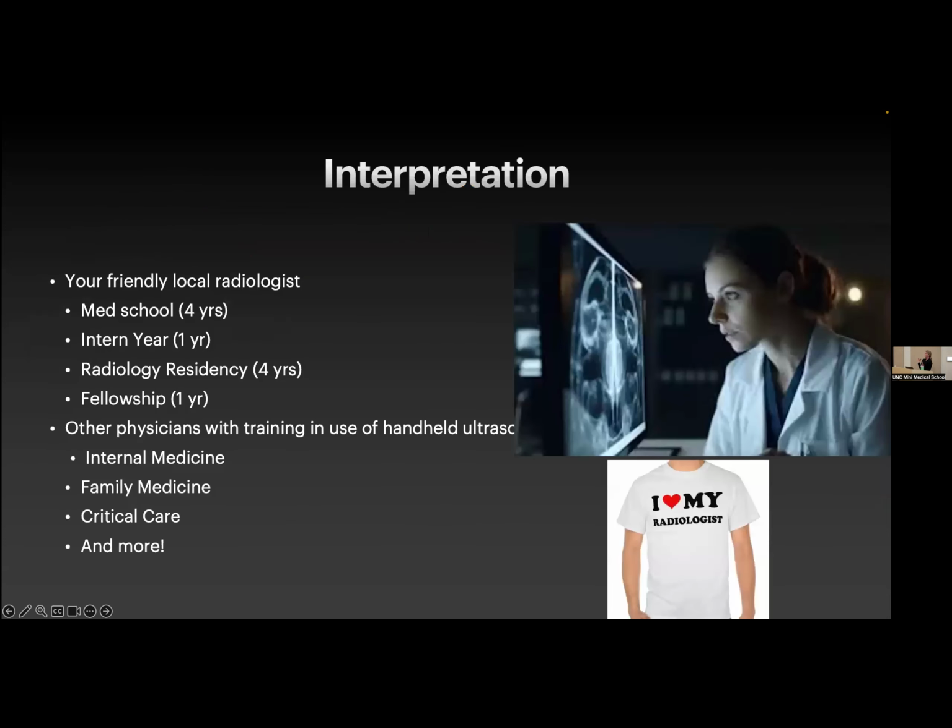So all the images are obtained by the ultrasound tech, and then they go to the electronic medical record. This is where it varies a little bit depending on if you are having a diagnostic radiologist read the study or if it's a point of care ultrasound, which is what clinicians who have been trained in it outside of radiology can use in real time. If you're having a diagnostic examination in the radiology department, it goes to the radiologist to read. And well, what is a radiologist?